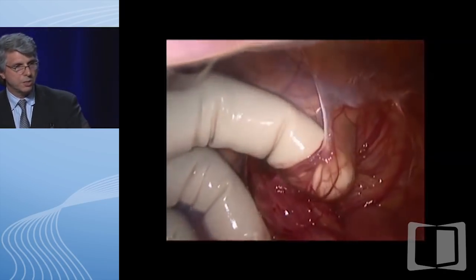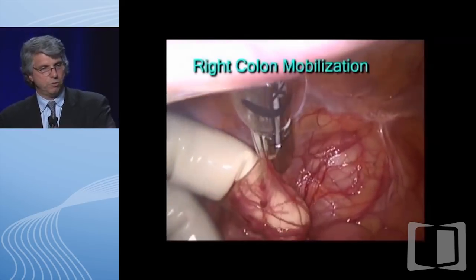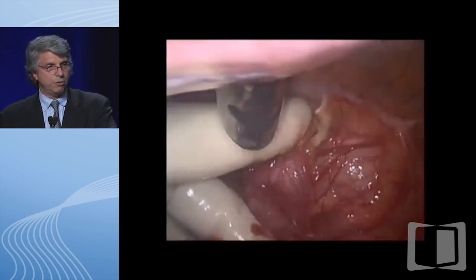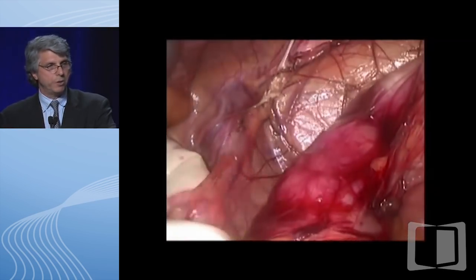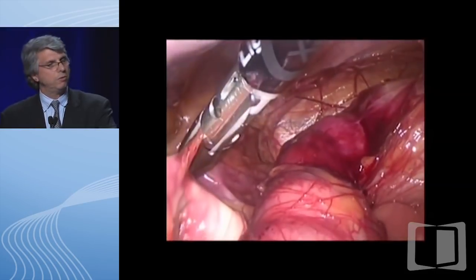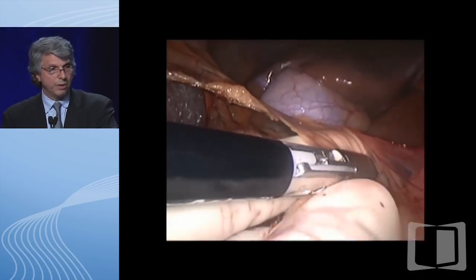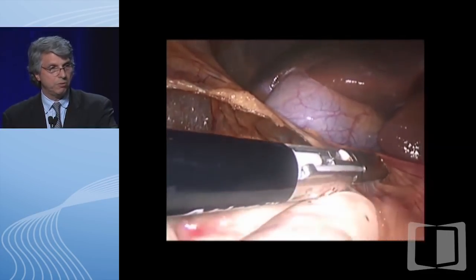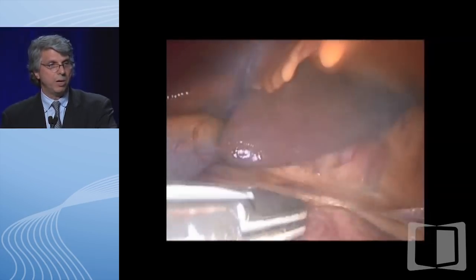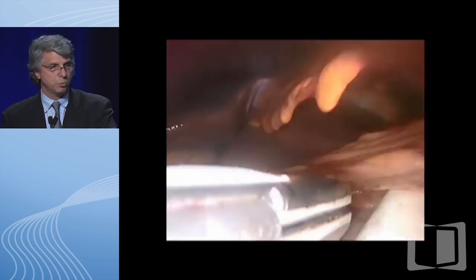This is an instrument called a gel port, where we actually insufflate through it and gain access into the abdominal cavity by injecting air. This is the right colon. The instrument you see coming into view is a way to fuse tissue—this particular one is called a ligasure. In our institution, we call this the MGI—man's greatest instrument. It basically fuses everything, gets excellent hemostasis, and is useful for dissection. You can see the gallbladder and the liver in the distance. This is the hepatic flexure, and we have to be very careful to avoid the kidney, the ureter, and also the duodenum.